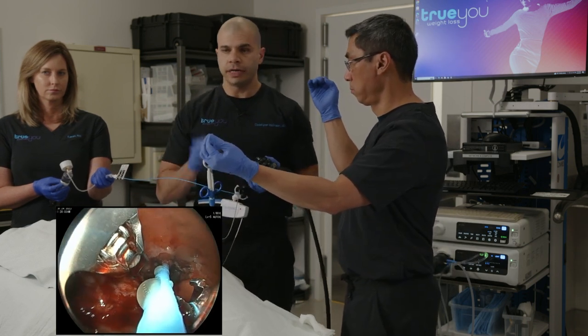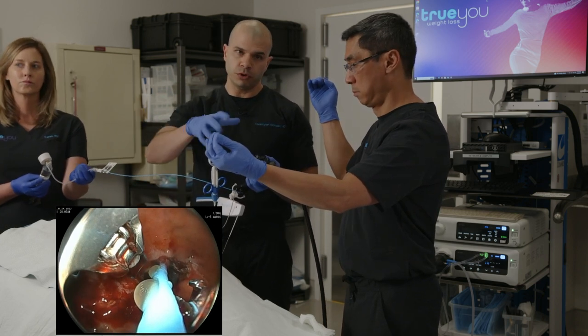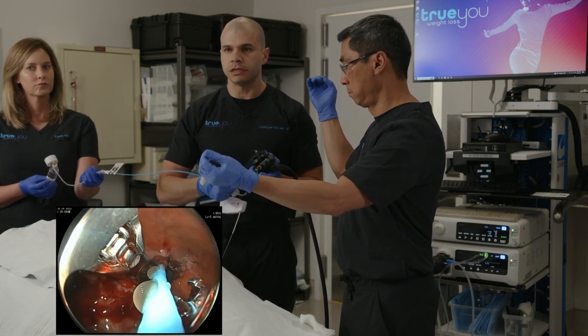Once in a while, we'll encounter an outlet that's not overly dilated, but we're dealing with a large pouch. And in that scenario, we might focus more on the pouch, less on the outlet. But in most cases, the issue is the outlet.